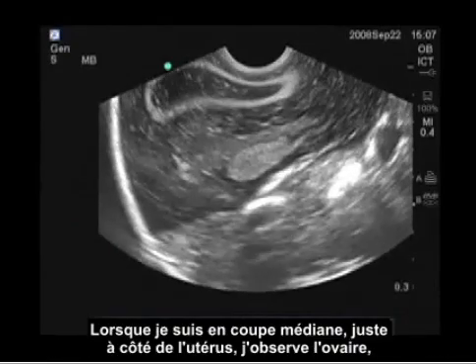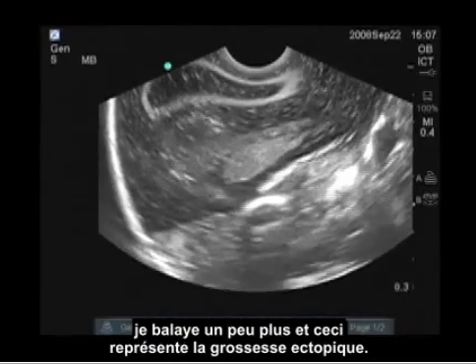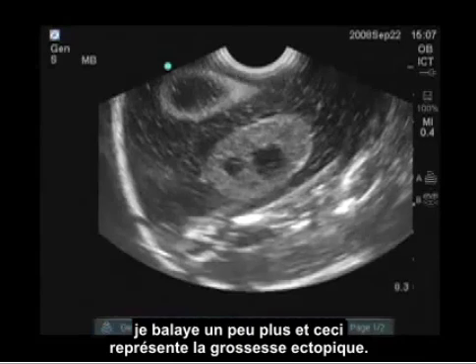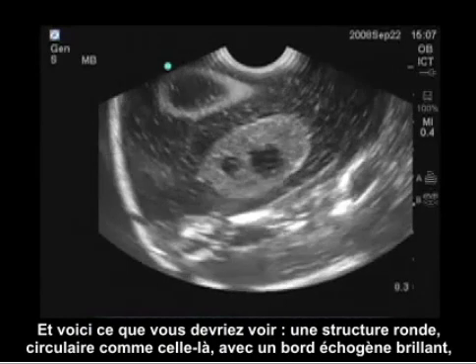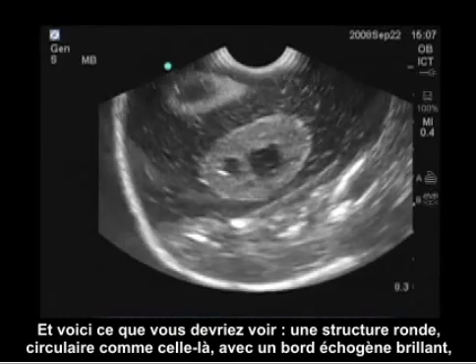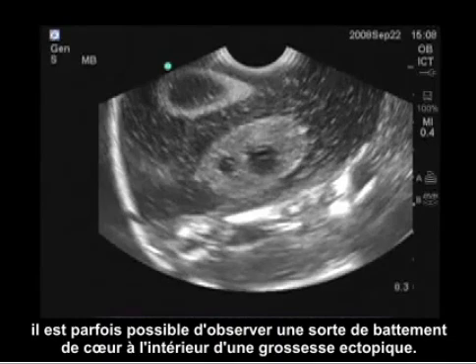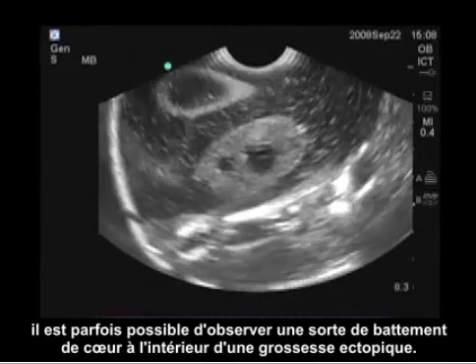When I'm medial, just beside the uterus, I see the ovary. Scanning out a little further, this represents the ectopic pregnancy. This is what you should see: a round circular structure with a bright echogenic brim. It is also possible to sometimes see a fetal heartbeat inside the ectopic pregnancy.